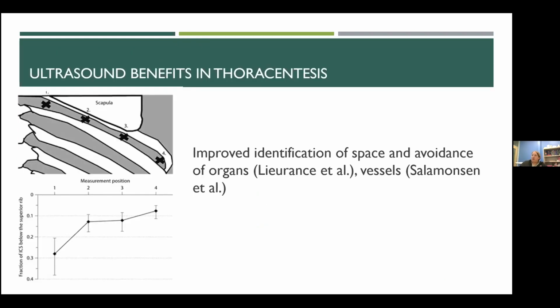Again, looking at your identification of your space, you're trying to avoid these blood vessels, right? You have blood vessels running along the ribs, and we assume that they're in the same position for every patient, but we know that's just not true. When they scanned a large number of patients, it seems that when you measure along, sorry, this pointer does not want to cooperate.